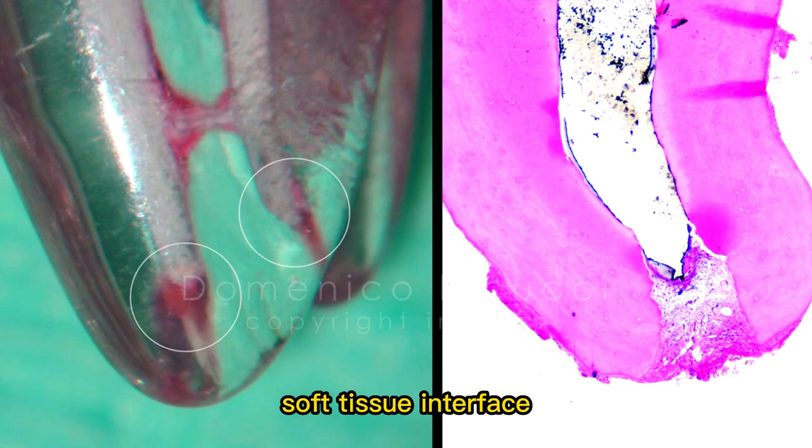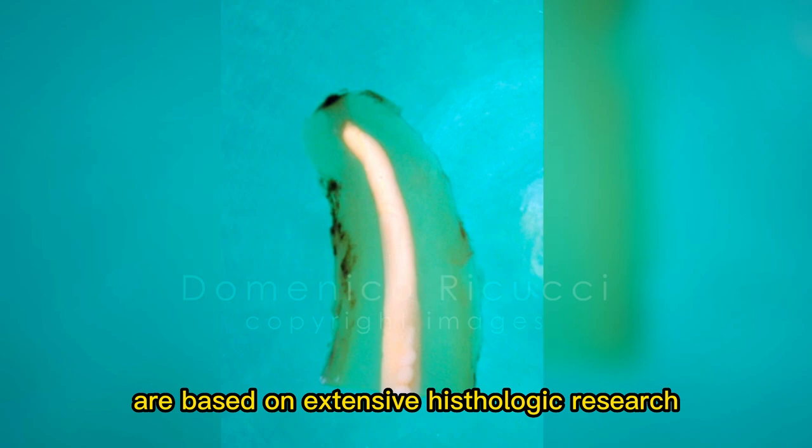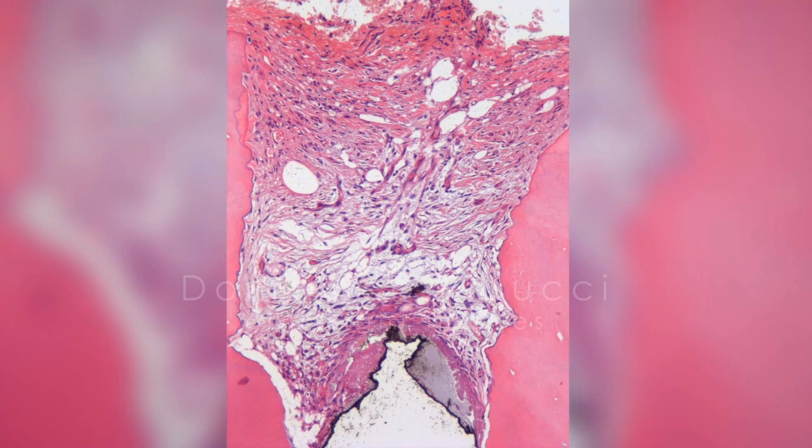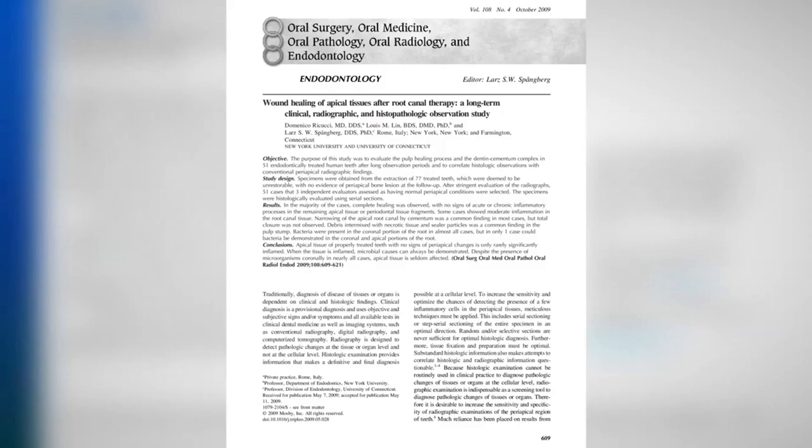All these clinical recommendations are based on extensive histologic research on large numbers of human teeth treated endodontically. To be continued.